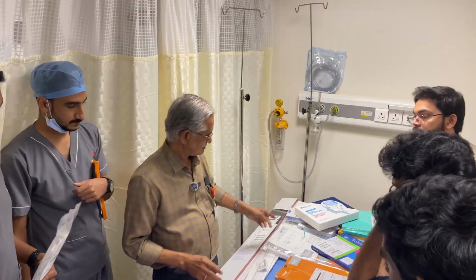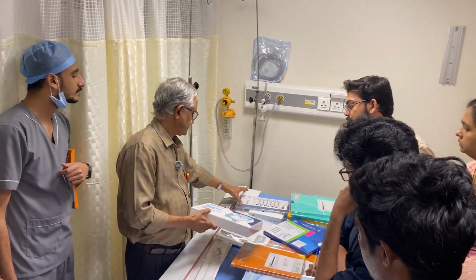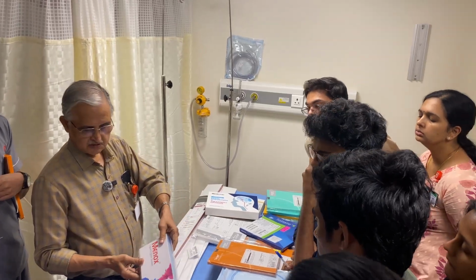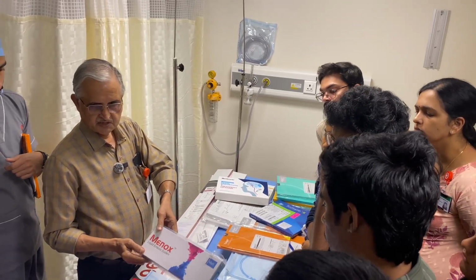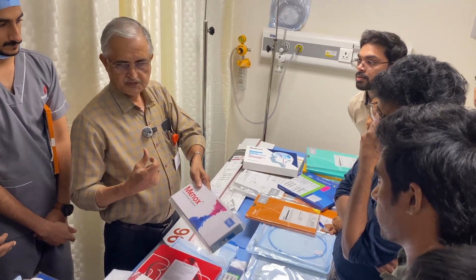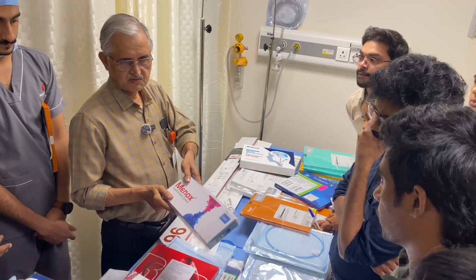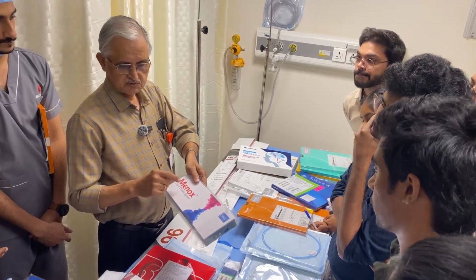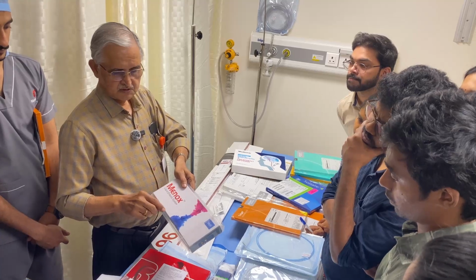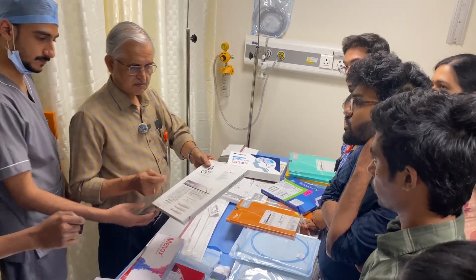Okay. Embolization of AVM, sometimes we use liquid agents like this Onyx liquid embolic agent. You can inject slowly and it will take a little time for it to solidify inside. So you keep on injecting into the AV malformation, and for injecting this there is a special type of microcatheter.